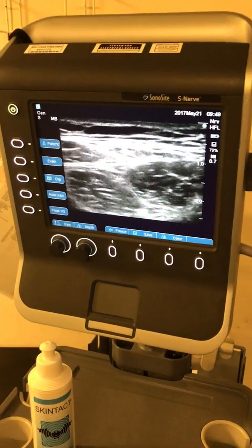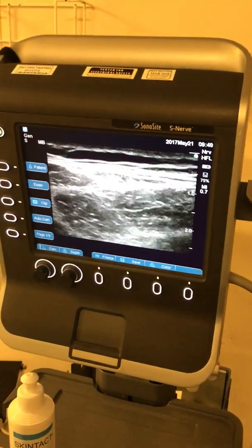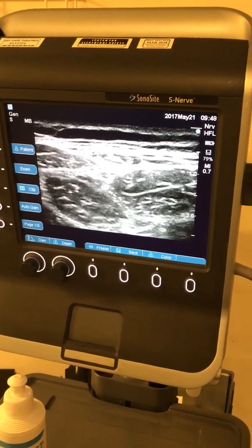Here you go — and that's your LFCN standing in front of you. It's a fat-filled tunnel, so it's triple FT: fat-filled flat tunnel.